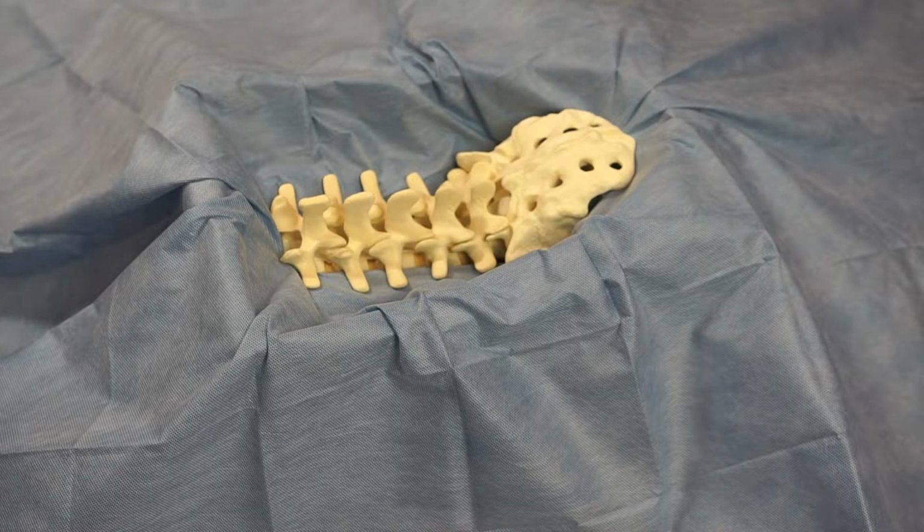If a decompression procedure is indicated, perform a conservative laminotomy, partial facetectomy, foraminotomy, or other decompression procedure. In order to facilitate proper placement of the implant, the facets may be trimmed. Preserve a sufficient portion of the facets to provide adequate biomechanical stability.